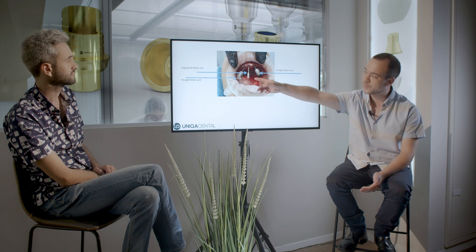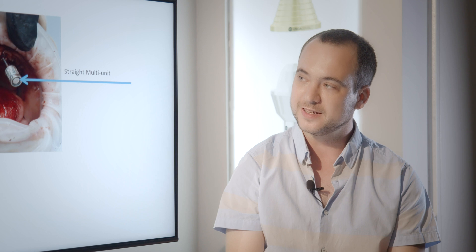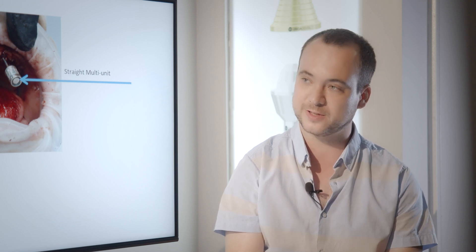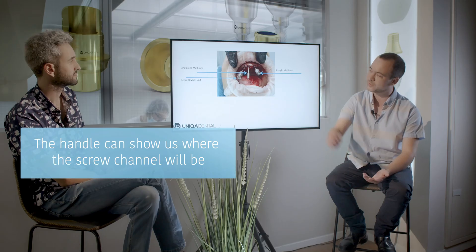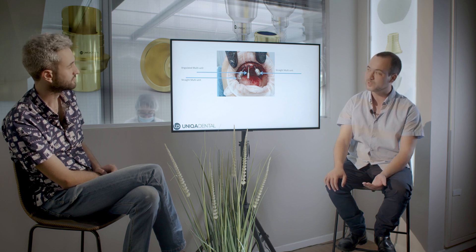When you're using an angular multi-unit, it's hard to know exactly where the screw channel will be. For angulated multi-units, we have a type of handle that helps us position the multi-unit on top of the implant, and with that handle we can see where the future axis will be. The axis of the implant goes one direction, but the screw channel axis will be about 30 degrees palatally, which you can see by the handle of the multi-unit.